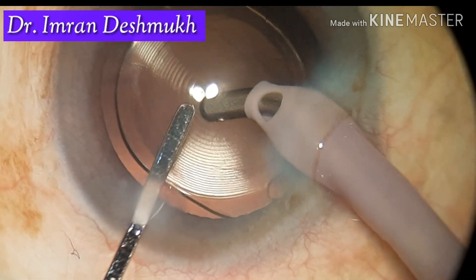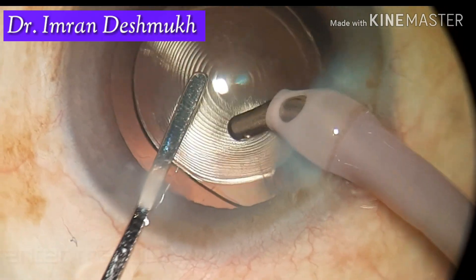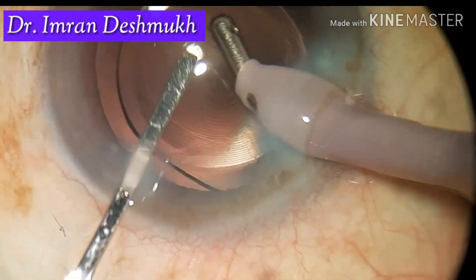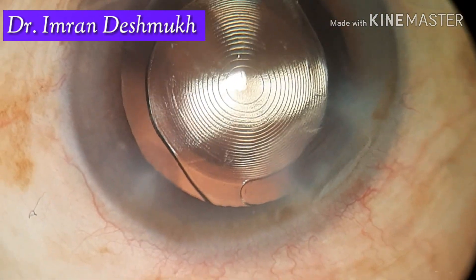I always go behind the lens and try to remove the viscoelastic. You can also center the IOL using your IA probe. A well-centered IOL will always give you better results in the postoperative period. I hope this video was helpful — thank you all for watching.